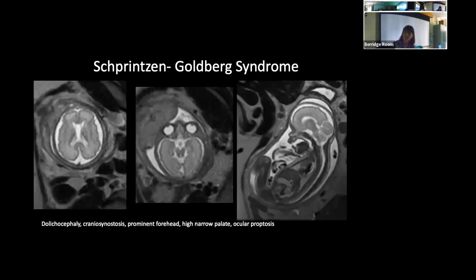This is actually a case that came from Cambridge. So this is the normal molar tooth sign that we're all taught about for Joubert syndrome. This was the case we had, where we got the elongated peduncles, but we hadn't got any interpeduncular fossa. But the rest of it was there. So this one I reported as, this wasn't typical of Joubert's, but had some of the features of Joubert's. The family had a history, not of Joubert's, of something else. And this is what the geneticist came back with and tested the family for it. So it was a genetic pull-out of all the information and trying to go back to the MR as to what we could see phenotypically.